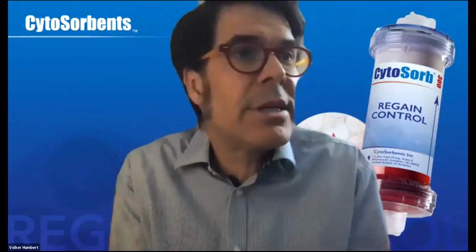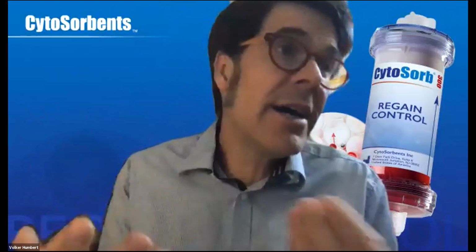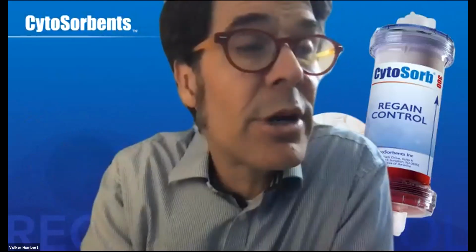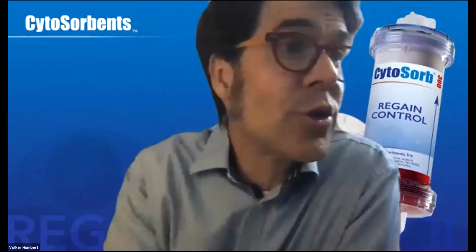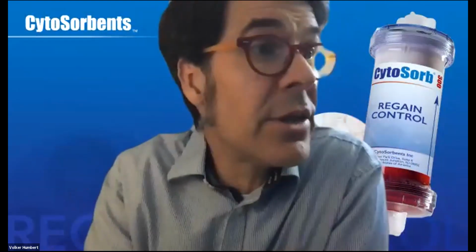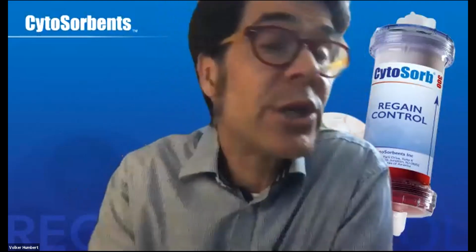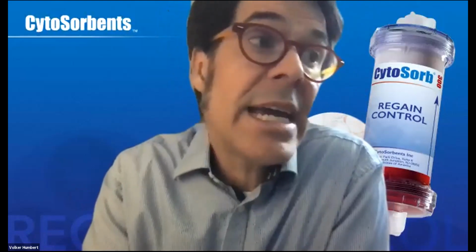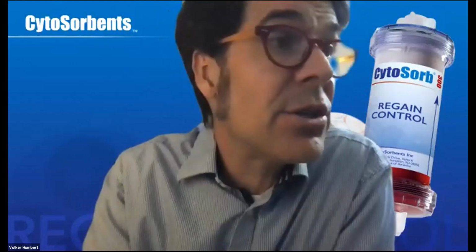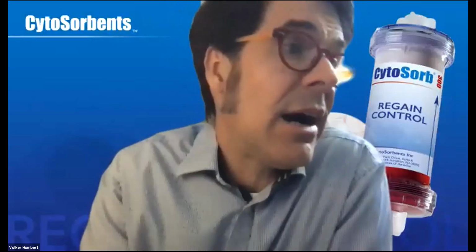It's a bit like when you want to prevent things, there has to be a certain risk which you want to avoid by your approach. However, if you were using Cytosorb in what we now know as indications like endocarditis, aortic surgery, or rivaroxaban and ticagrelor removal, I would say there was a very high percentage of patients really benefiting from this, especially in endocarditis.